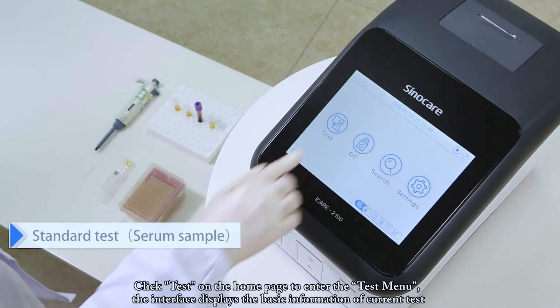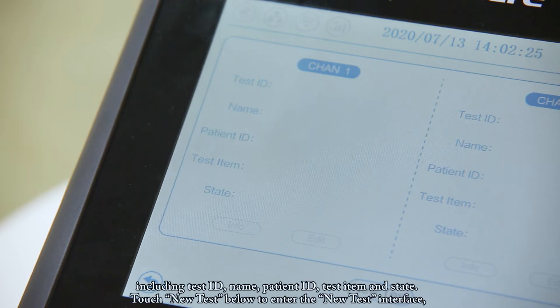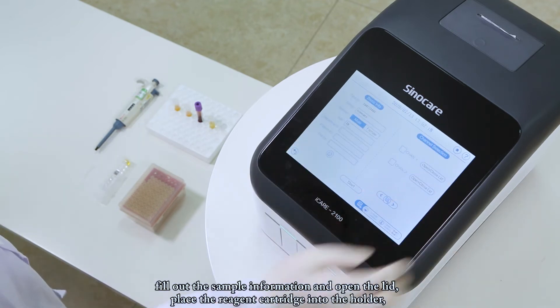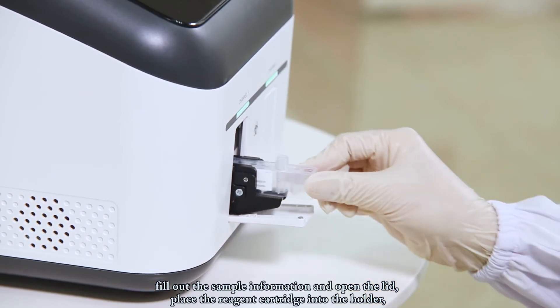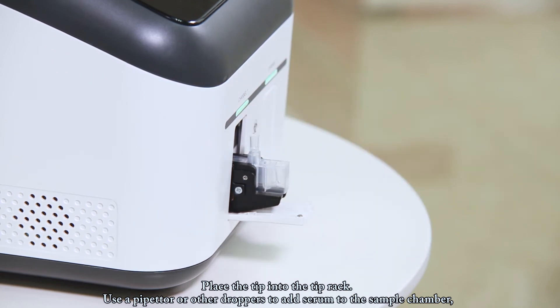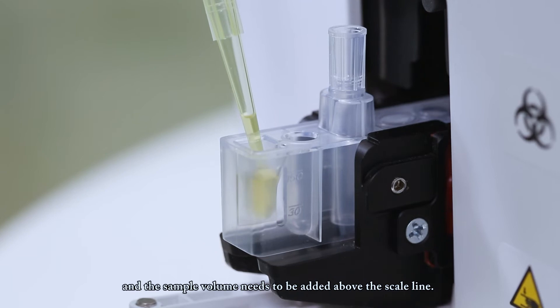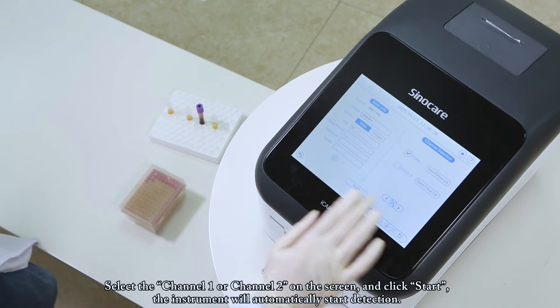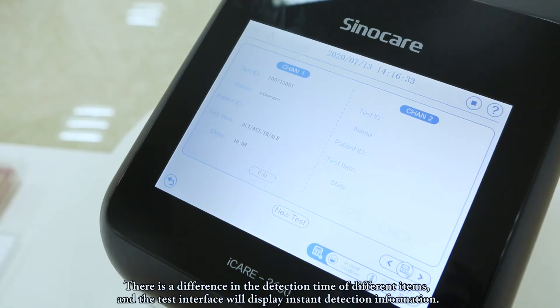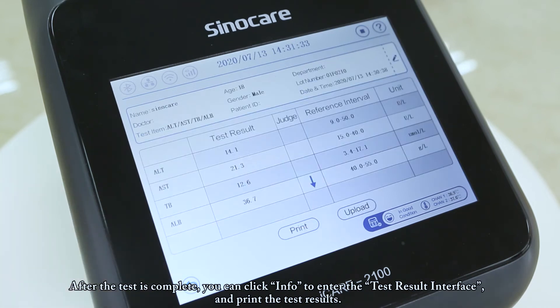Click Test on the home page to enter the Test menu, which displays basic information including Test ID, Name, Patient ID, Test Item, and State. Touch New Test to enter the New Test interface. Fill out the sample information and open the lid. Place the reagent cartridge into the holder, pushing it to the bottom until you hear a slight click. Place the tip into the tip rack. Use a pipette or dropper to add serum to the sample chamber above the scale line. Select channel 1 or channel 2 on the screen and click Start. After the test is complete, click Info to view the test result interface and print the results.